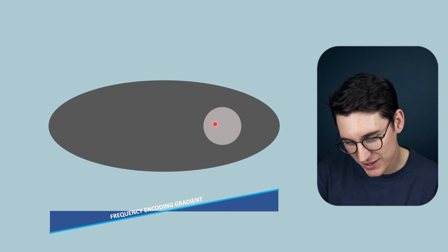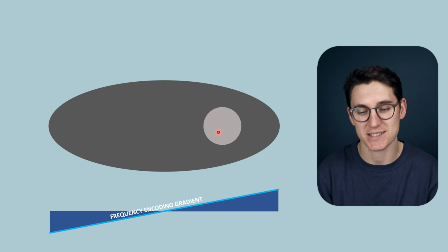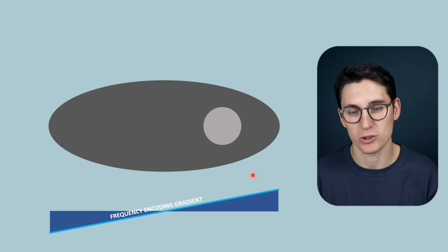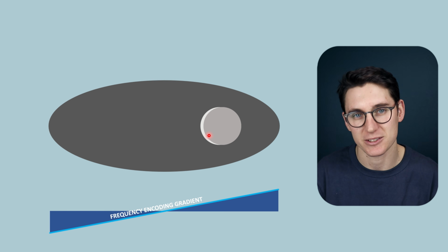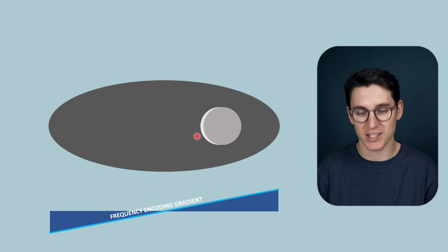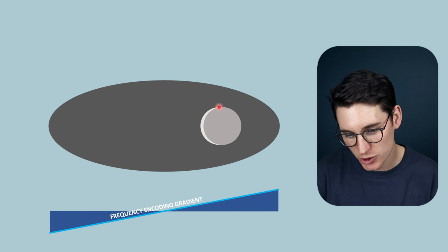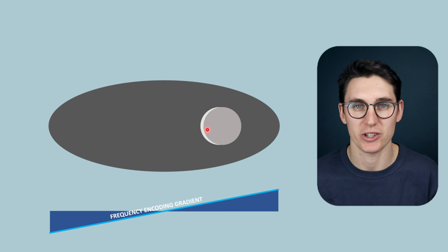So what is going to happen is when this fat signal comes back and we Fourier transform, splitting those frequencies and placing them along the x-axis, we are going to falsely place the fat signal slightly to the left on this image, at slightly lower frequencies than the surrounding water. So the first difference in our chemical shift is that we get a shift to the left of fat. Now, why is the signal brighter here? Well, underlying this, we've got water giving off signal at this frequency, at this location on the x-axis. And those signals are then combined by the MRI machine, by that Fourier transform. So we get a bright rim surrounding our fat. We've misregistered that fat along the frequency encoding direction.